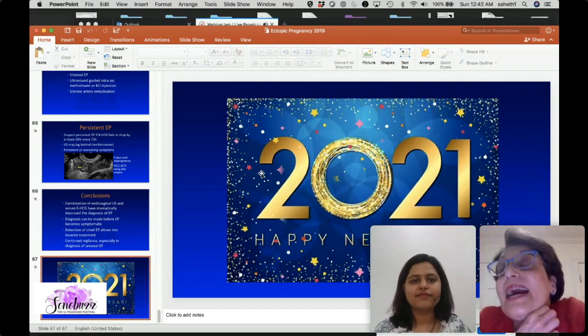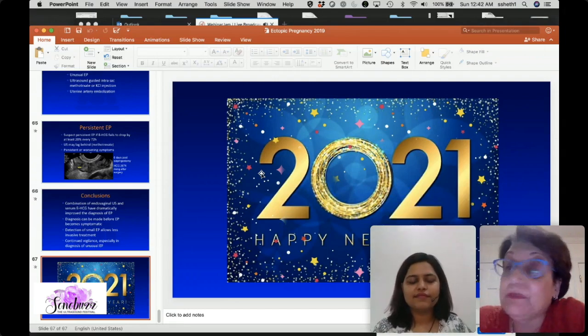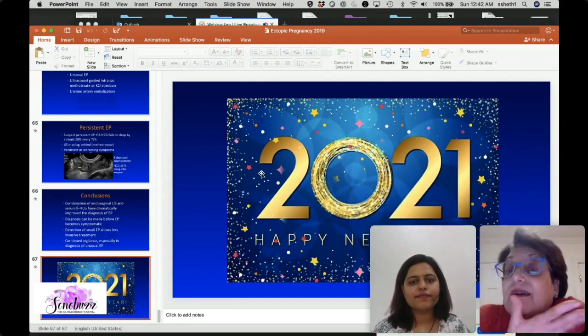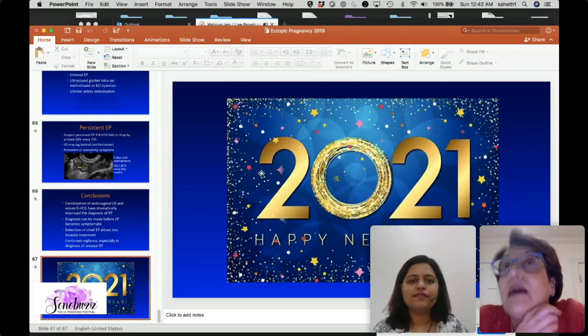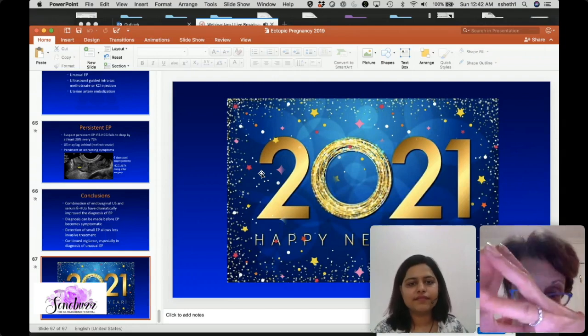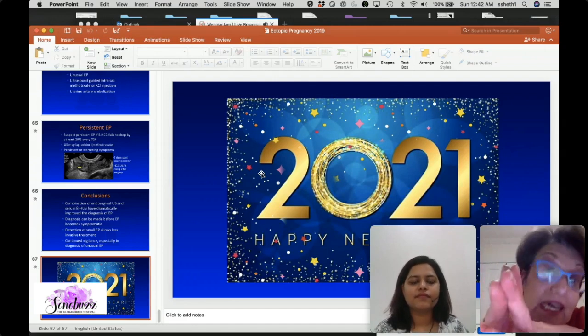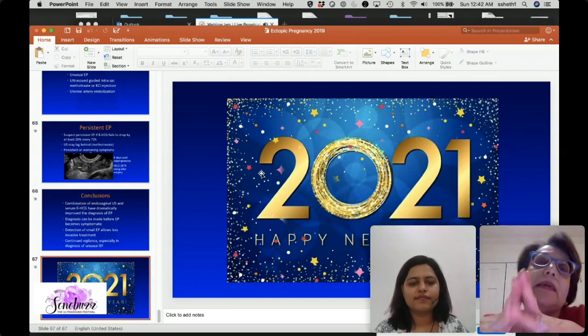I think ovarian ectopic pregnancy is very, very uncommon. If people have seen more, I would love to hear their cases. If you see an ovarian lesion in a pregnant woman, the vast majority of the time it is going to be a corpus luteum.